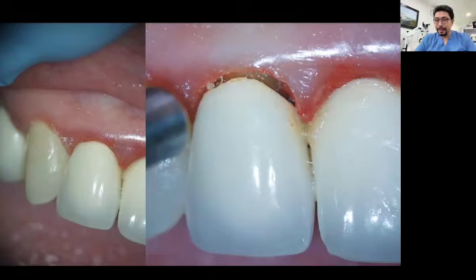For now, that's it. I will have a conversation with the referral doctor, and he will be in touch with you to explain what to do. And then you just need to send the pictures to the referral doctor, explain what is happening, that the root canal treatment is not necessary, and that's it. The referral doctor will deal with that problem. And you didn't even have to tell the patient anything bad about the referral doctor. So it's a very easy way to have good communication with the referral doctors as well.